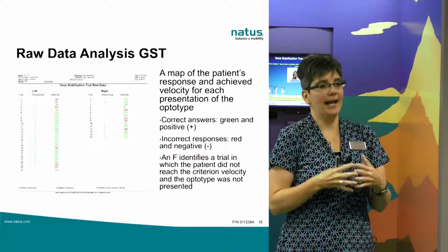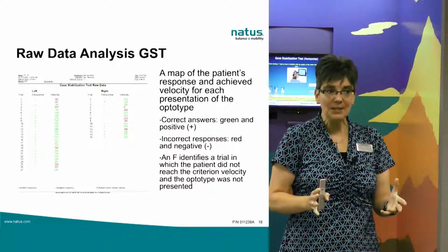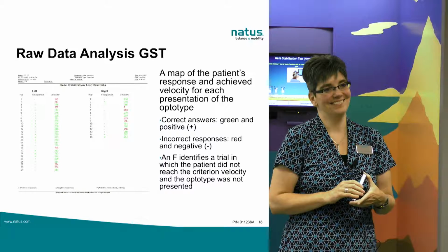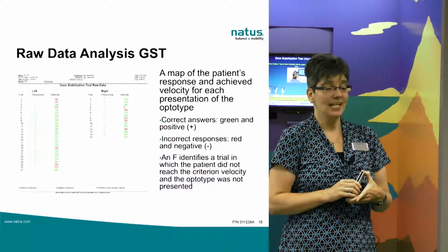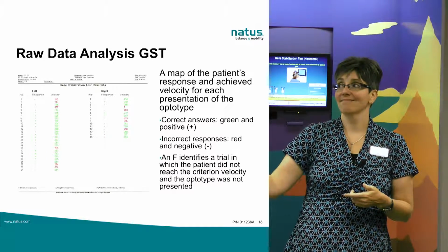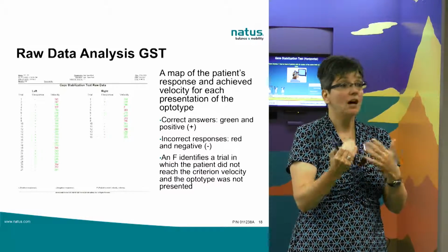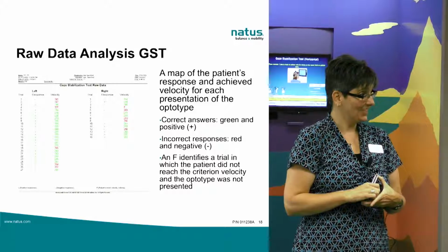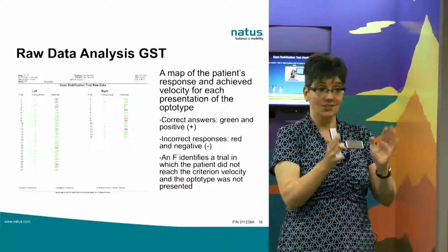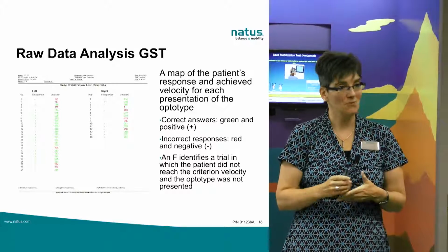What if your patient halfway through the test says, I need to stop. I'm not feeling well, I have to stop, and you haven't gotten a score yet? Let them rest. If you have to stop the test, the good news is you still have this. So you will be able to go in and get a good sense of their speed and their accuracy. So if the patient can't complete the test, you'll still have raw data. Okay, you'll just stop the test, you'll save the test, and when you go in and pull up the raw data, you'll be able to get an idea of how that patient performed.